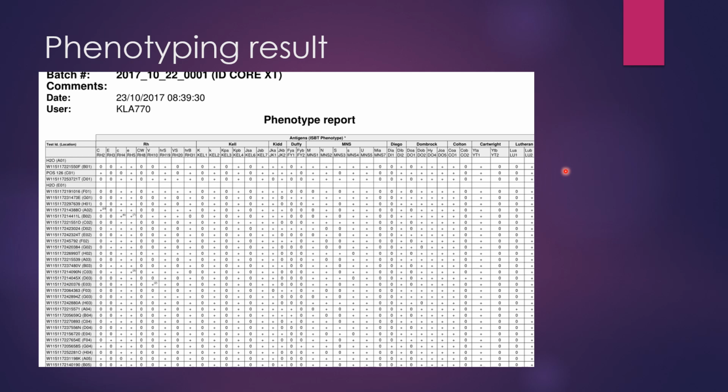And then we also have a phenotype result. So we discussed in the genetics lecture, when you're doing DNA genotyping, you can only give a predicted phenotype because you're not actually testing the red cells. So you always want to say predicted phenotype, because there's always things that can happen in between DNA to protein or DNA to antigen. And we do find that sometimes our DNA type will say they should be positive for big C or big K, but then serological testing will tell us that they're negative. And then we have to investigate what's going on.